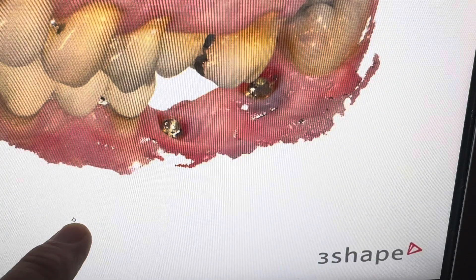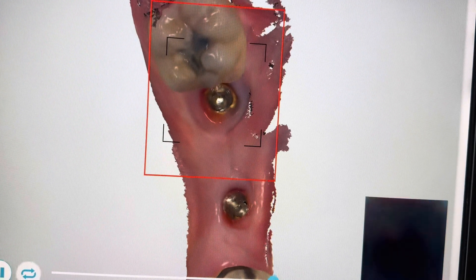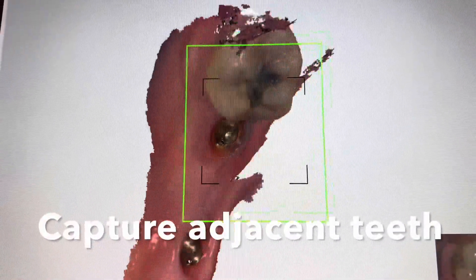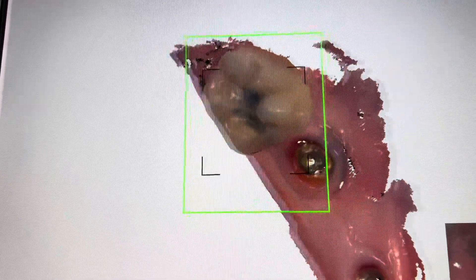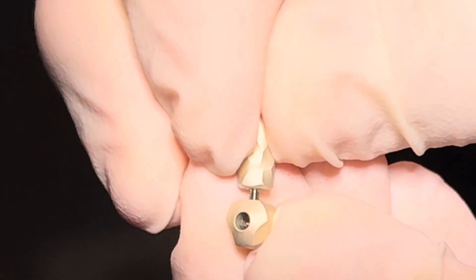You can see we're picking up the multi-unit position, but what really matters is where the polos are, because the bridge fabrication is going to be based on where the polos are — they are essentially lateral scan bodies. When we do this we get a really nice scan, and we have to pick up the two adjacent teeth before we place the polo scan bodies.